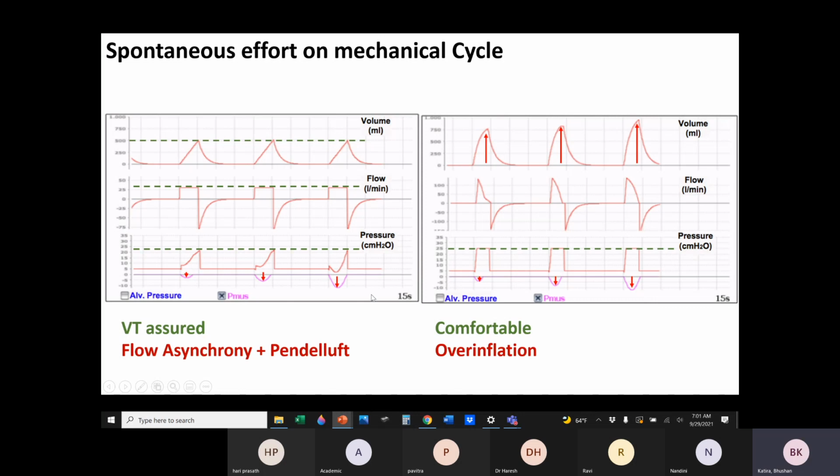As a result, if you want a patient to have a definitive assured tidal volume, you may want to control the negative pressure generated by the patient's muscle effort while on volume control, so deeply sedated or paralyzed, etc. But once the patient is out of the red hot ARDS phase in the first week, and you want the patient to be comfortable and use less sedation, then go to pressure control, let them breathe themselves and determine their own tidal volumes. That kind of clinical application is the purport here.